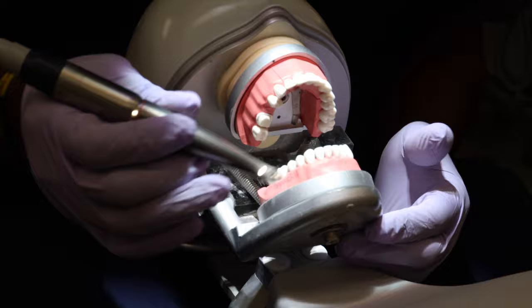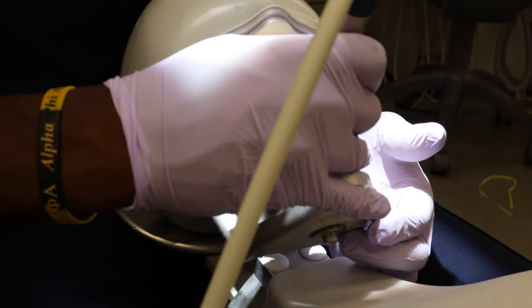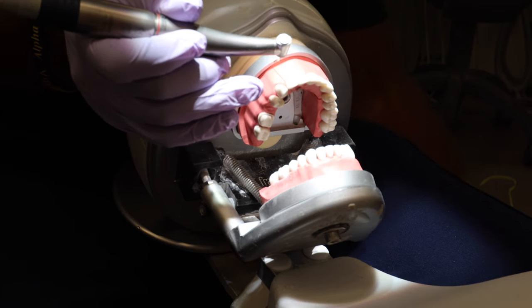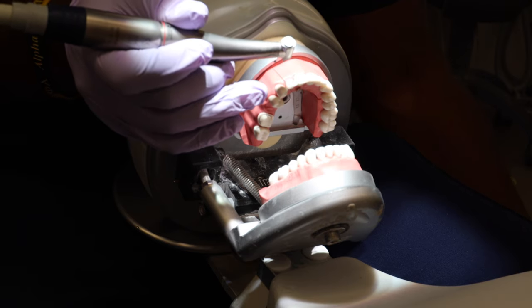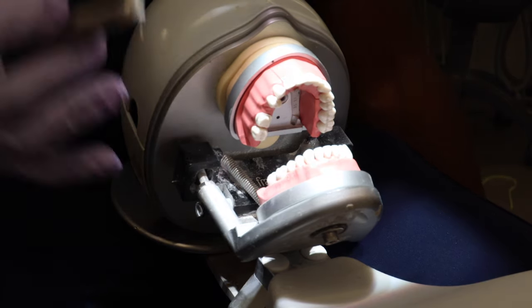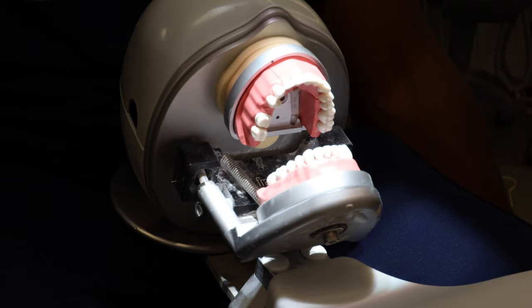This was the 8 and 6, they told me 2 parallels. This 2 parallels makes me kill myself. What does the 2 parallels mean? So the lingual cusps are just supposed to be like flat across? If only the buccal side is supposed to be biplanar? Oh, were you talking about the, like, my bad. Ignore that. The biplanar thing? Yeah, you were talking about the buccal, like being not biplanar. The buccal side of the occlusion. Yeah, gotcha.